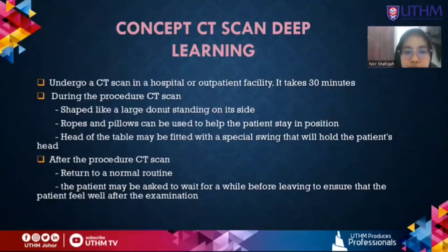So after the CT scan procedure, the patient can return to a normal routine. In some cases, the patient may be asked to wait for a while before leaving to ensure that the patient feels well after the examination.